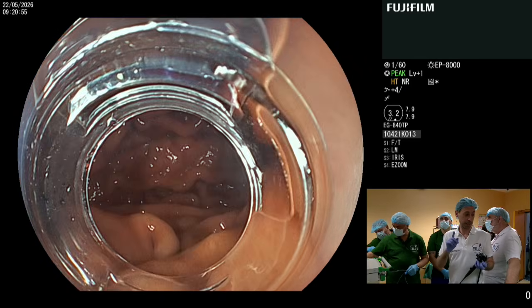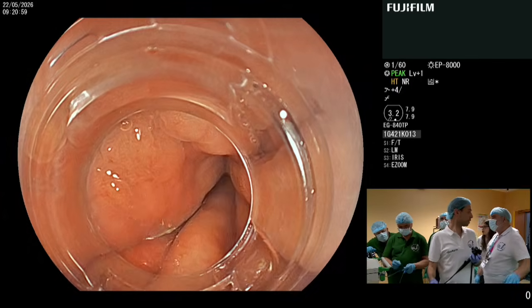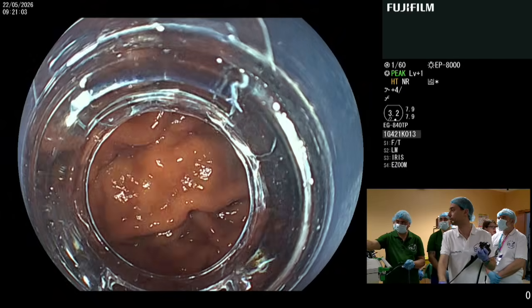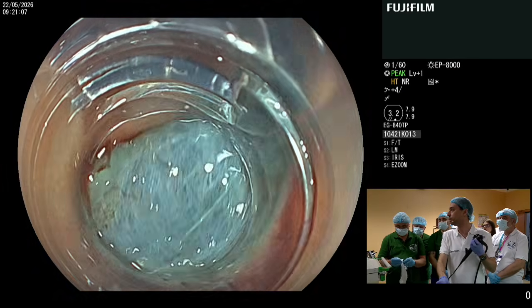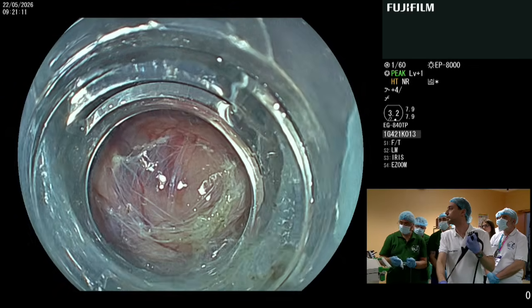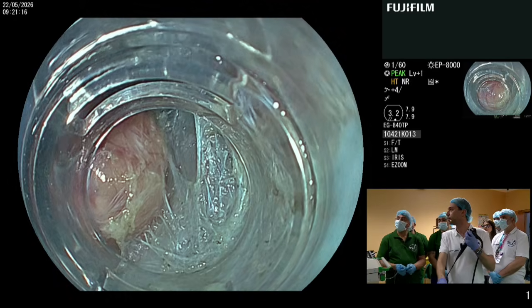We do have to administer antibiotics during this procedure. Have we given anything? All right, so we have to give prophylaxis with, for example, augmentin or ciprofloxacin, metronidazole, because we may induce perforation. All right, so this is how it looks at this point. All right, let's continue.